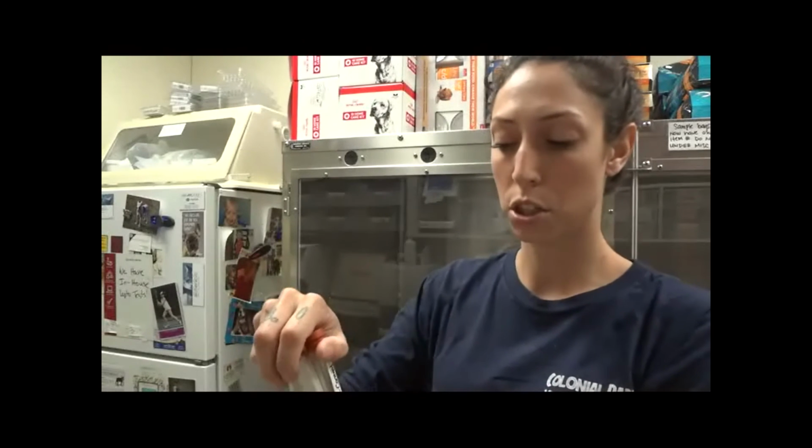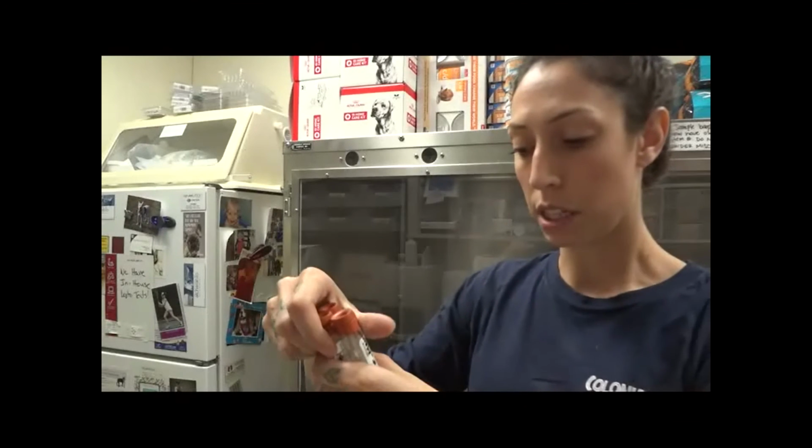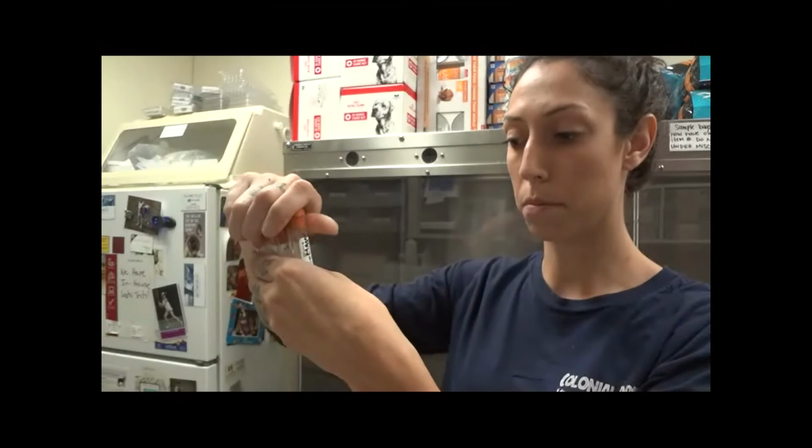Alright, so we've got our test tubes after they've incubated for 30 minutes at room temperature. We're now going to spin them down at 3,400 rpm for 1 minute. I don't see any apparent agglutination or hemolysis so far. Now we're going to take a drop from our major and a drop from our minor and place them on a microscope slide and cover them with a cover slip.